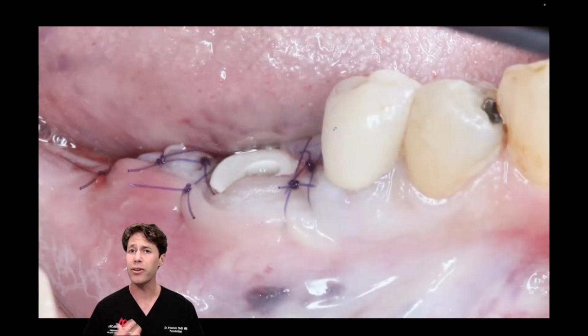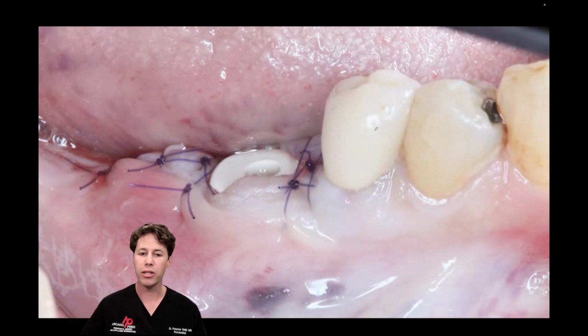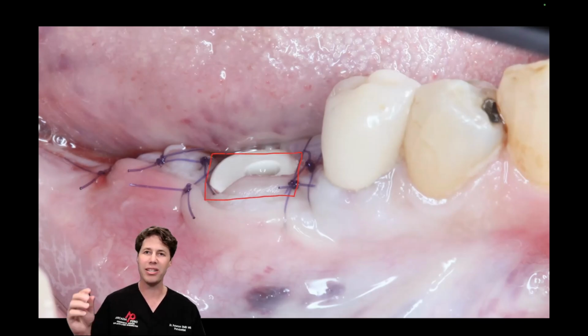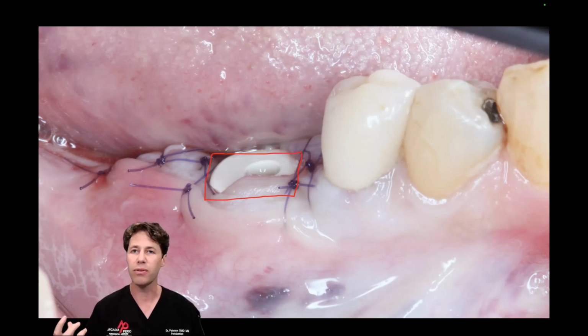So the other thing to keep in mind is the timing of the implant as you're putting it in, right? It needs to be in a certain position to allow for this peek abutment, which is more rectangular in shape. It's indexed, so it's engaging, right? So my implant has to be timed just right. So you have to be mindful of where that internal connection is. And then we close it up with 5-0 Glycolon from Osteogenics.